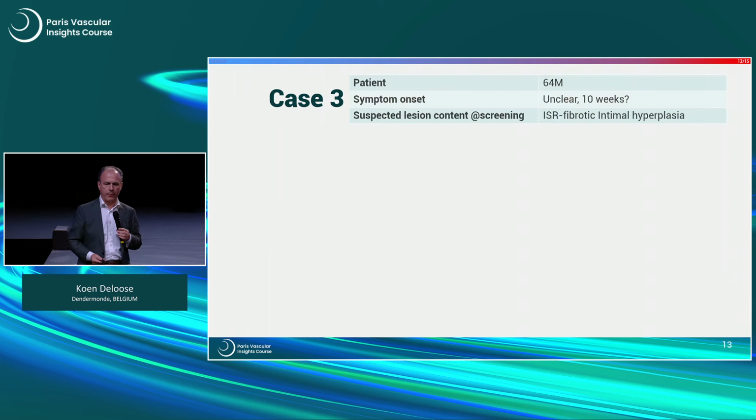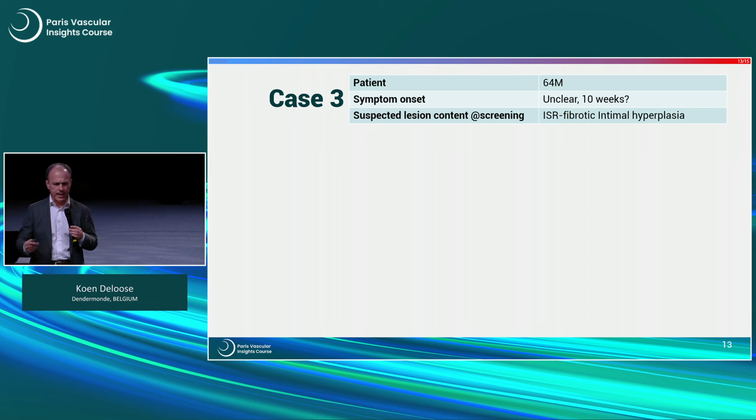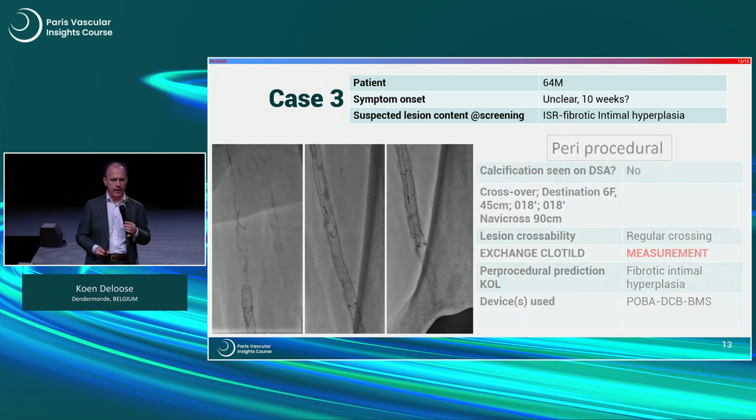To end, just a final case, because it's not always that clear: a 64-year-old male patient, very unclear story, confused, 10 weeks, yes or no, in-stent restenosis. So this was the case that I showed you as a kind of introduction. You've seen how my wire was passing.